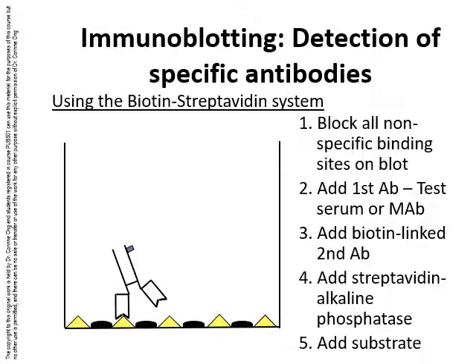The test serum, which is referred to as the first antibody, is added and incubated for an hour, after which the channels are washed to remove any unbound material, which may be non-relevant antibodies or proteins. The second antibody is then added.